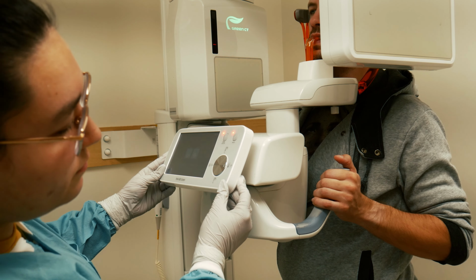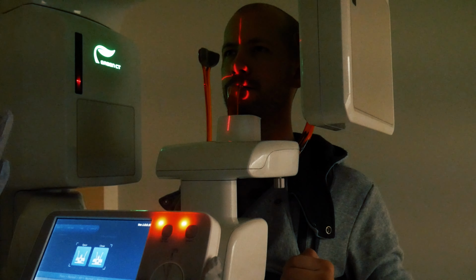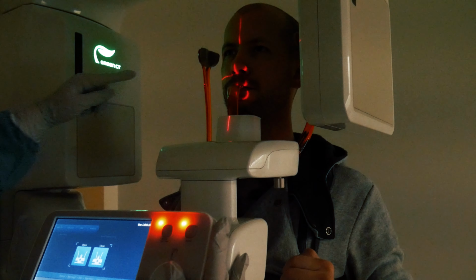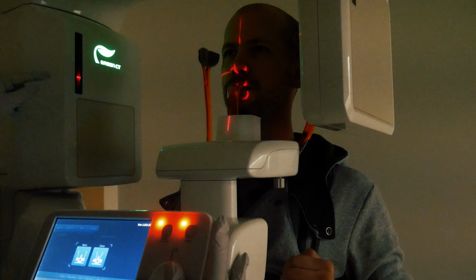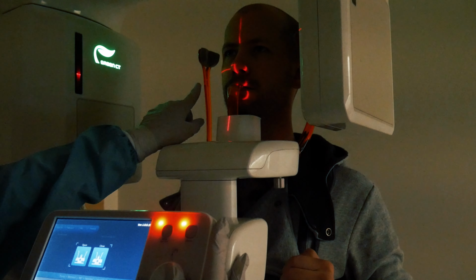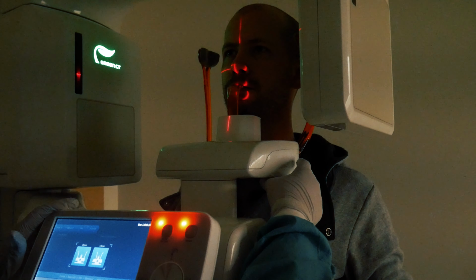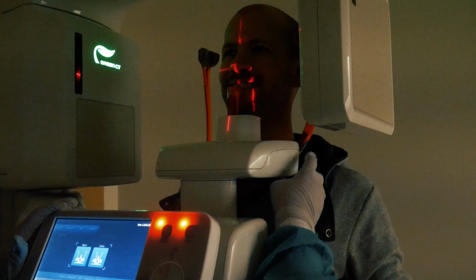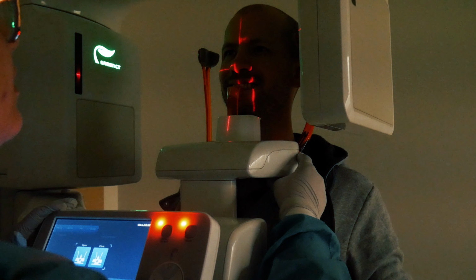Okay, alright, so once your patient is in position, you want to make sure that these red beams line up. The one that goes across is typically with about the tip of the nose, and then smile big for me. The one that goes up and down, you want to make sure it's in the center of the canine.